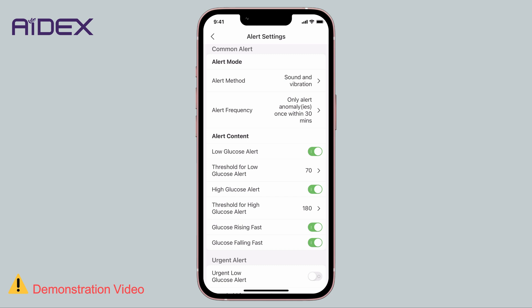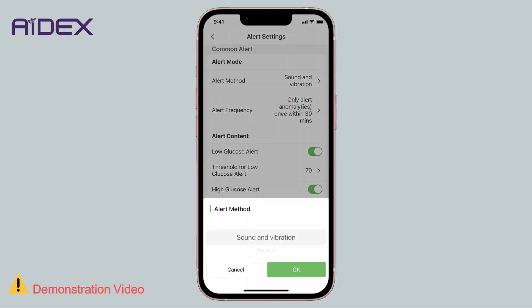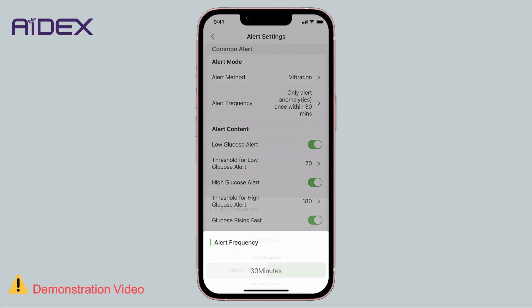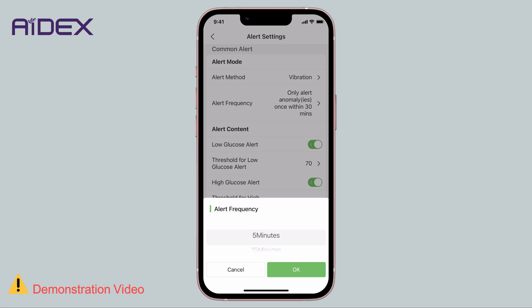Note: all four alerts can be configured to provide sound and vibration, sound only, or vibration only. You can also control the alert repetition frequency: every 5 minutes, 15 minutes, 30 minutes, 45 minutes, or 60 minutes.